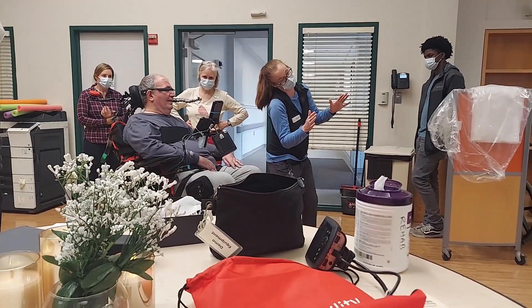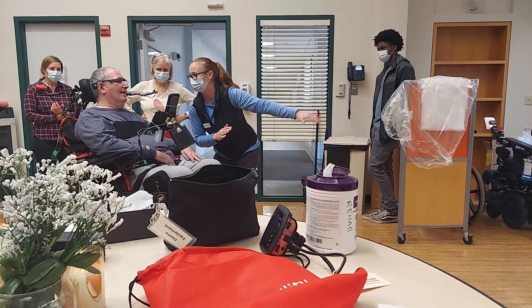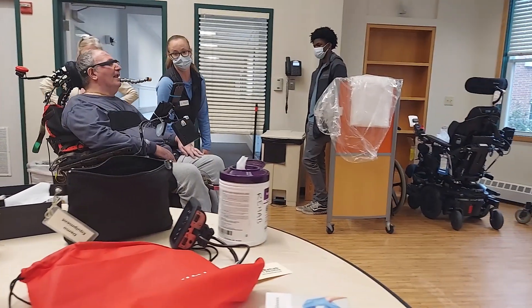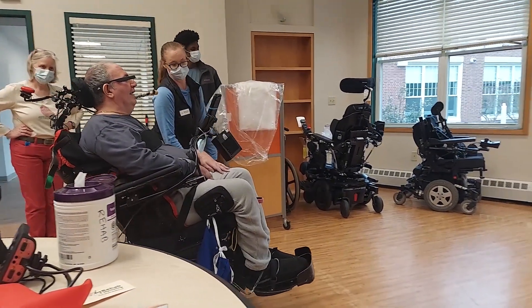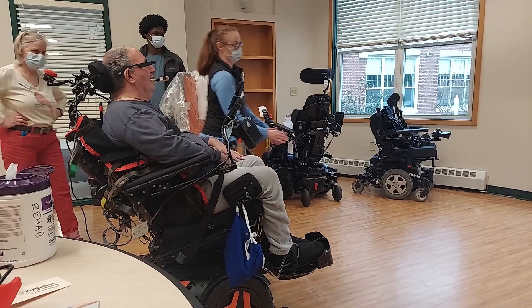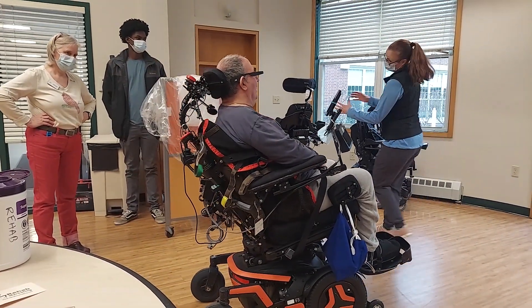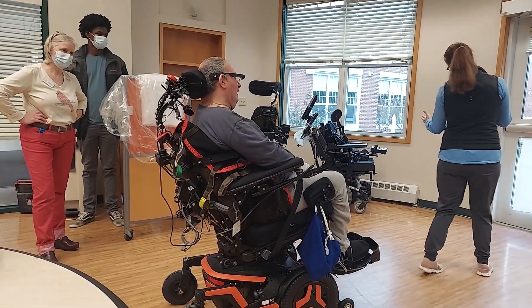If you want to tilt your head you can turn, but let's just go forward — see how far forward you can go, keeping your head back. Okay, it's going to go forward, there you go. Now remember, we're not going to look to the left, we're going to tilt our head to the left — ear to shoulder — we're going to tilt our head to the left.